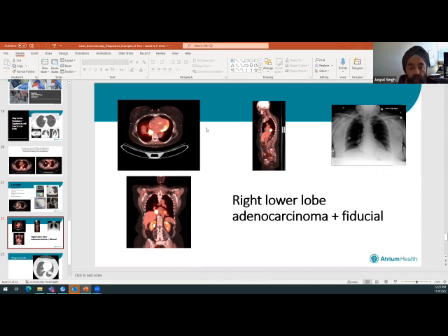Why do I say no biopsy would have been possible? Well, right next to this lesion, I tried to make it sort of where here's the liver, here's the heart, and the heart is right here, the liver is right there, and it's so deep that you almost cannot biopsy that without significant risk to other organs. And so she would have to hold her breath so precisely to get a needle into that spot. Otherwise, it's a major operation.